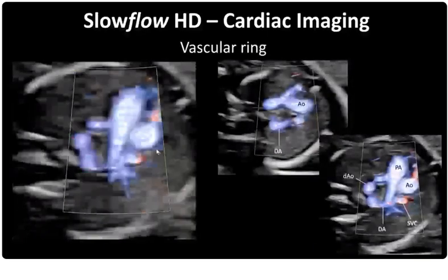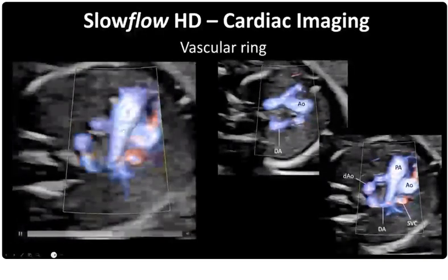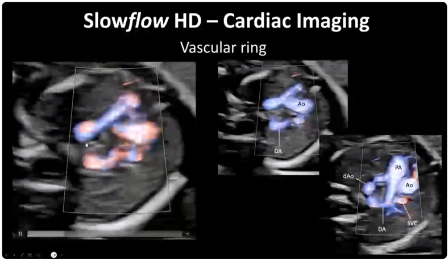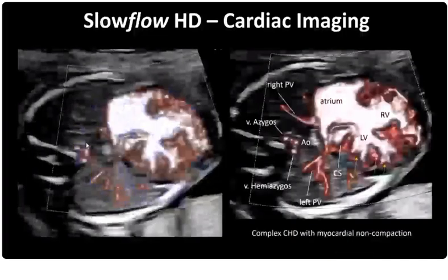So this is a very unique case of the vascular ring that demonstrates the left-sided arch that runs here on the left from the trachea, but the right-sided ductus arteriosus, which are connected behind the trachea and esophagus, and again represent the very rare form of the vascular ring.